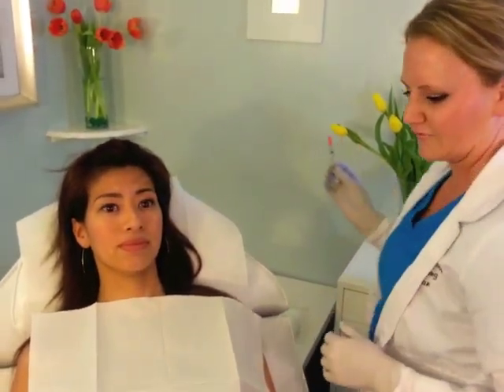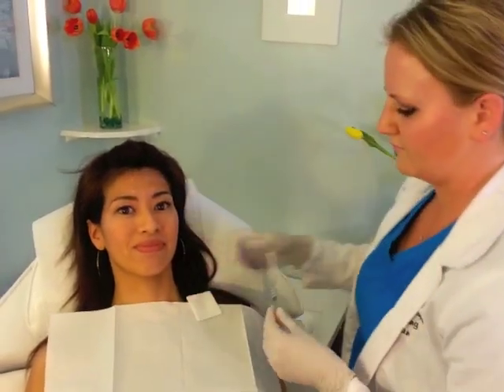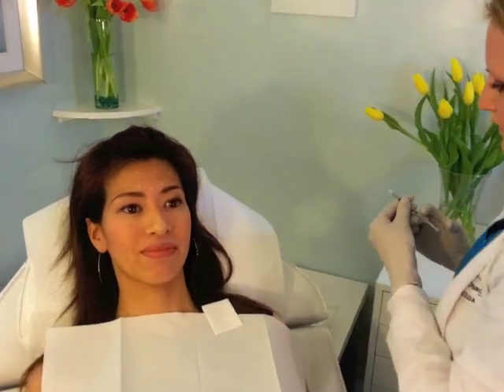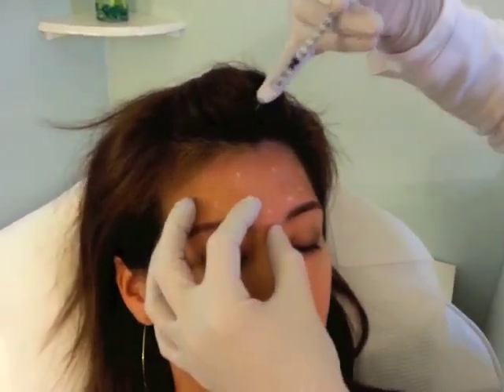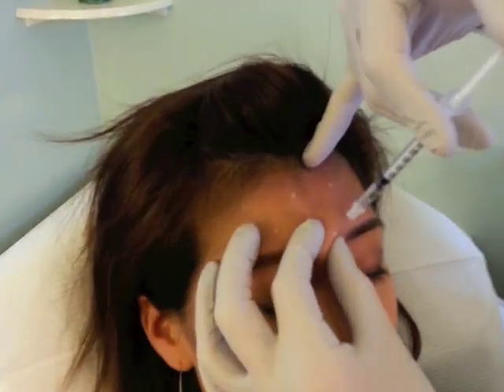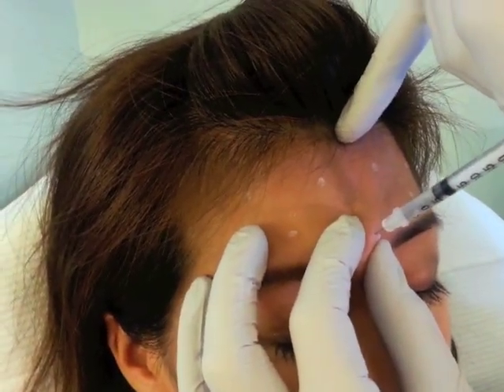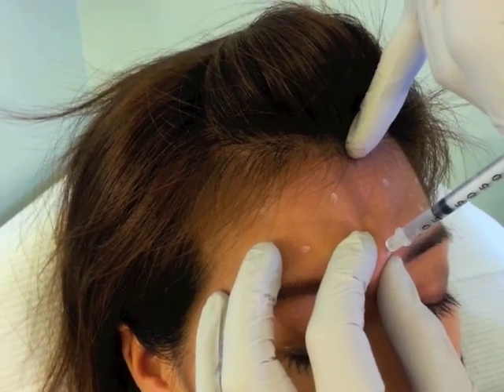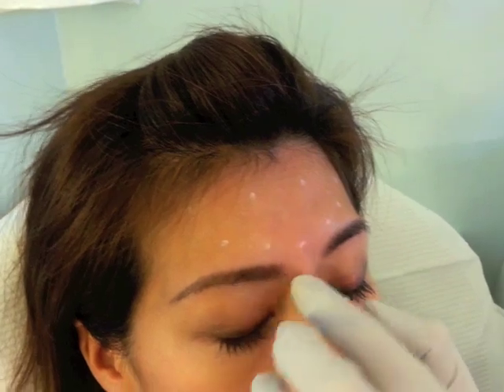Do you feel nice and comfortable to get right started? You'll feel just a little pinch of the needle but it shouldn't be too bad. Go ahead and close your eyes. We'll start right here in the middle — this is the procerus muscle. This is going to help with any of those little bunny lines that go horizontal across the nose.